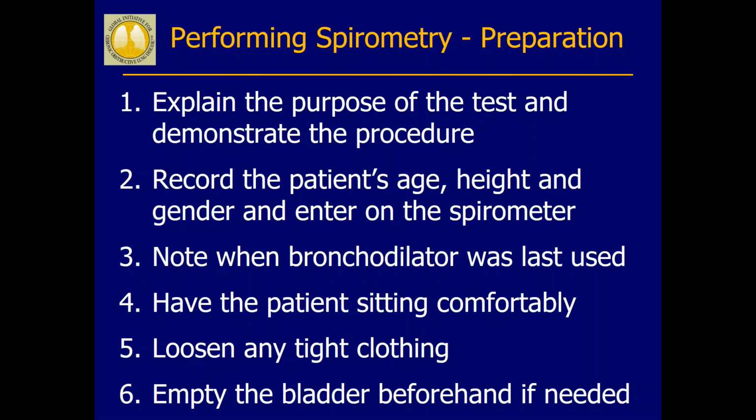Have the patient sit comfortably, loosen any tight clothing, and empty the bladder beforehand. Tell them if they need to use the restroom, they should go ahead, because the amount of air you take in and out is going to put a lot of pressure on your abdomen. If some patients have a full bladder, they may have accidents. Not in this list of steps here, I would recommend having the person sit in a chair that can be cleaned with Cavi wipes or bleach, so a vinyl chair or some type of non-porous chair, because of the amount of effort somebody takes. Some people may have issues with bladder control.